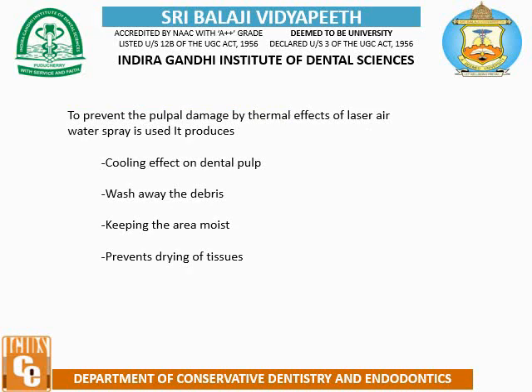To prevent pulpal damage by thermal effect of laser, air water spray is used. It produces a cooling effect on the dental pulp, washes away the debris, keeps the area moist and prevents drying of the tissues.